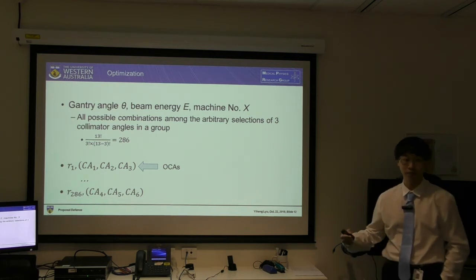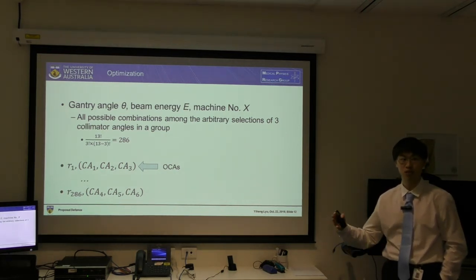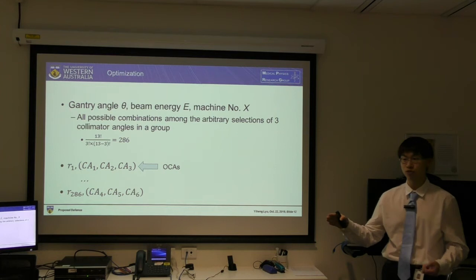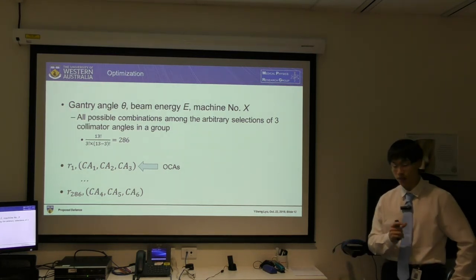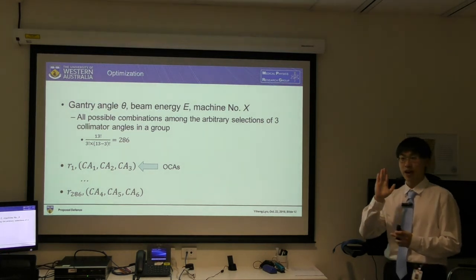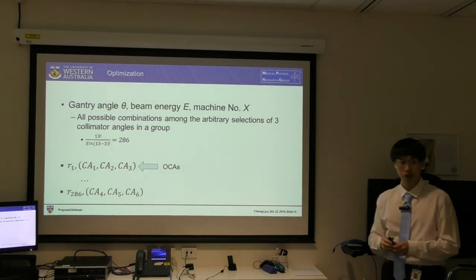Pachman also has some extra data acquired on Varian Linacs. I'm not sure if it's done here, so I might use those to compare the performance between the 2 brands. And I might use our Linacs downstairs to do some film measurements. I will use film and put it perpendicular to the axis of rotation of the gantry, and I will perform that. Okay.